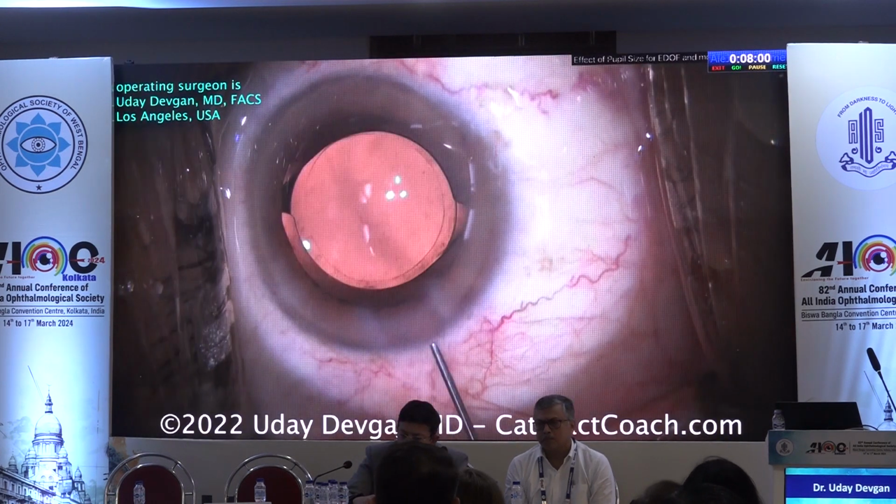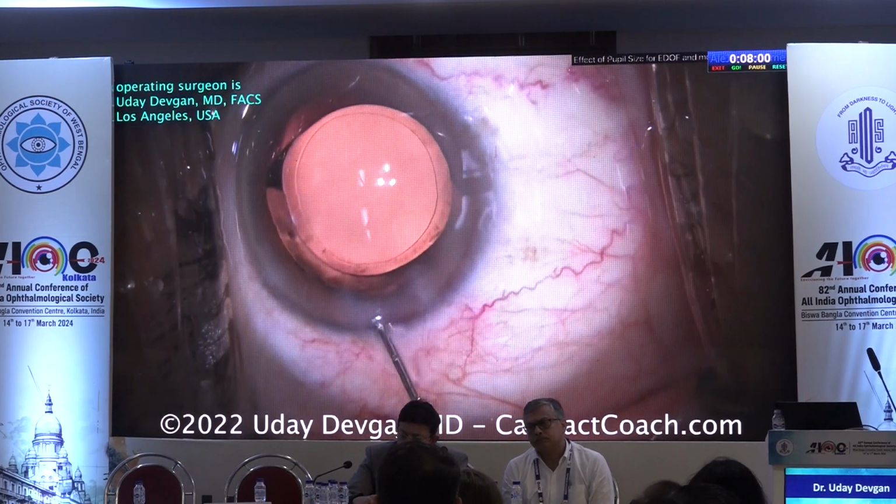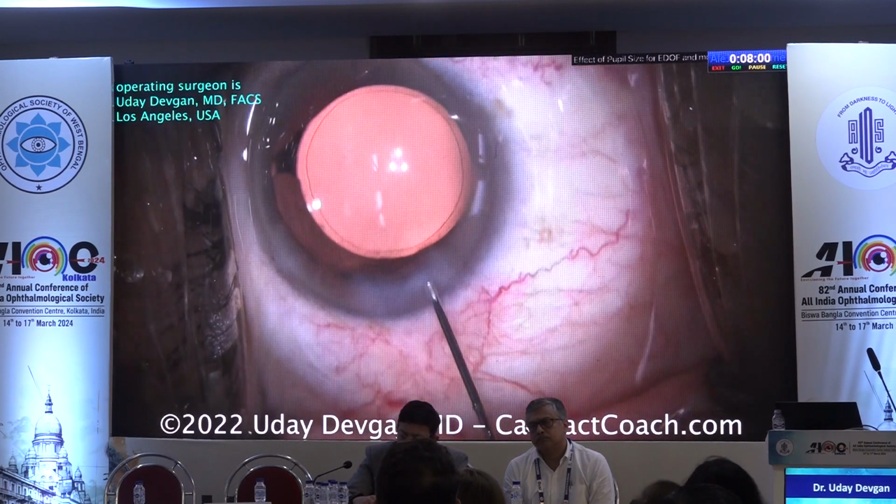So here's another case. Look at the patient here. The IOL is in the eye, nicely centered up, sealing up the incision here. And if you look carefully, you'll see this is, again, an EDOF lens with a central focusing element there. This is that Vivity lens.